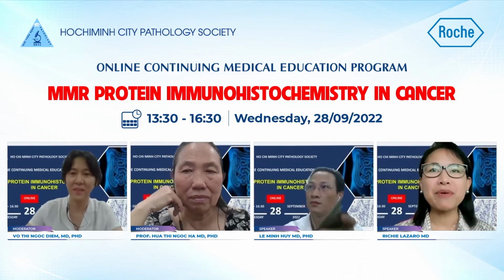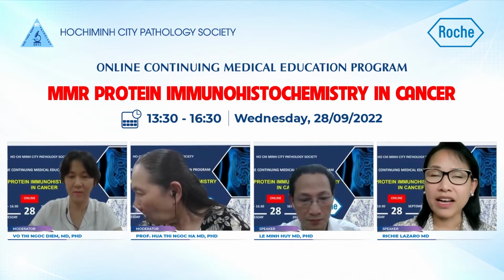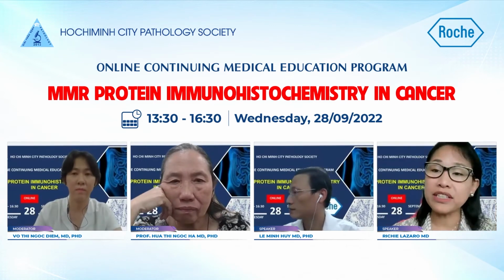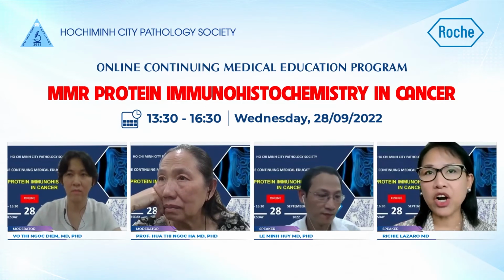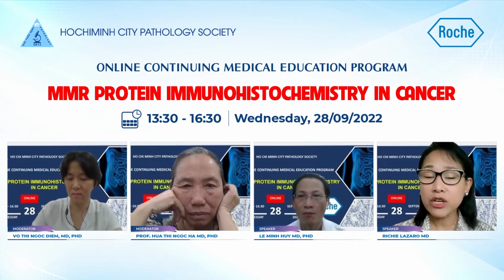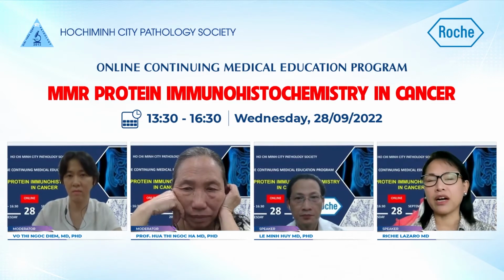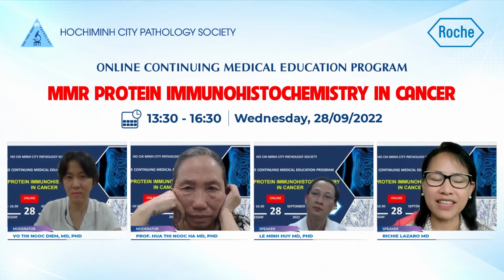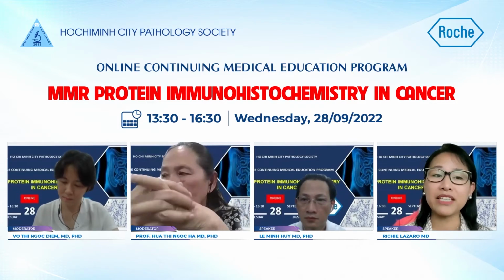The MMR protein can even be lost in non-neoplastic mucosa. So of course, the tumor is the area in question, whether it's the invasive or the in situ components. I will evaluate in it. But there are studies that show that if there is absence of MMR in the non-neoplastic mucosa, it may potentially also suggest Lynch syndrome. I don't recall the article and the author, but I'm sure if you look online, you will find that this has been published.